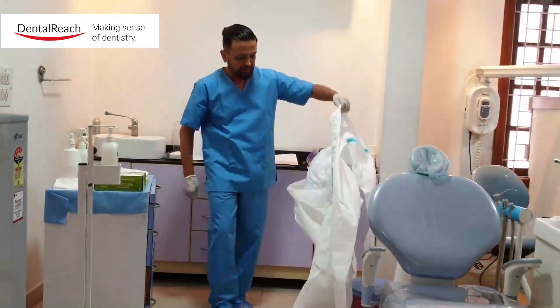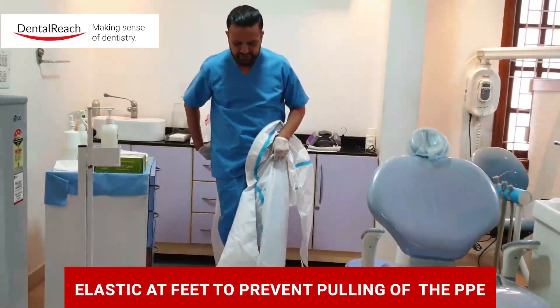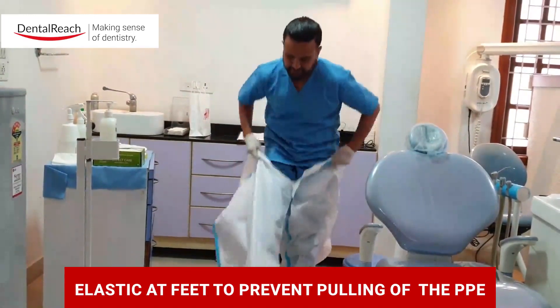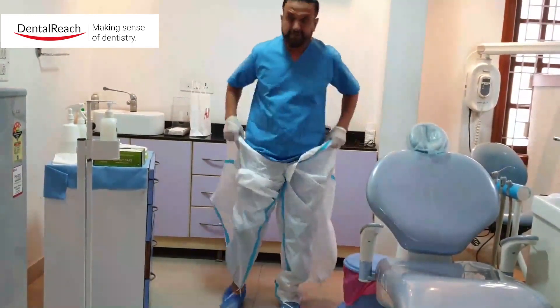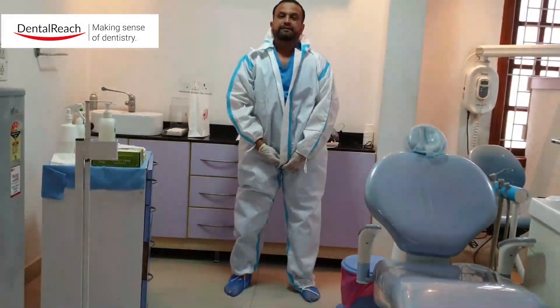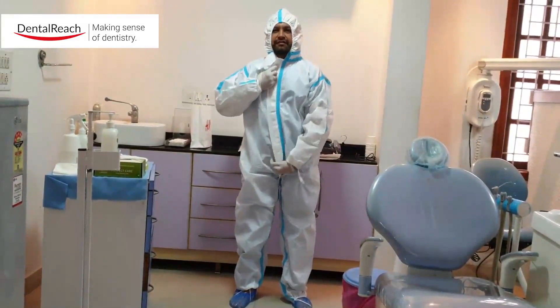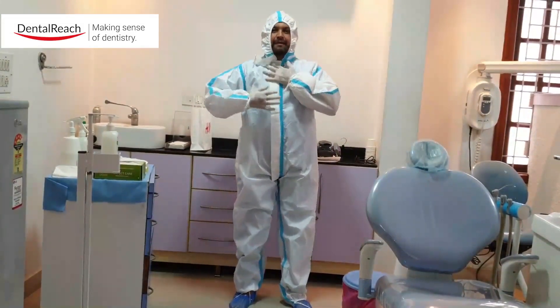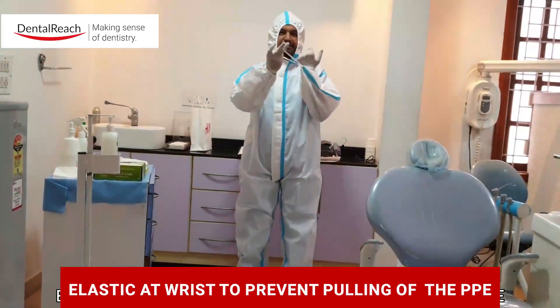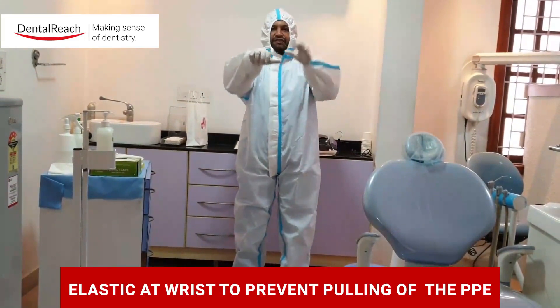At the edge you can see this elastic which is fitted onto the foot, just to make sure that it doesn't get pulled up. Zip it up, wear the hood, just make sure you release the tape here and then bring it onto the surface. This also comes with an elastic on the middle finger, just to make sure that this is stable.